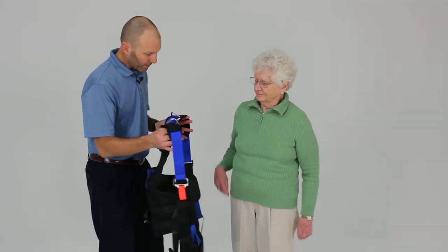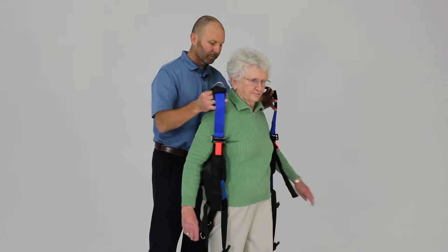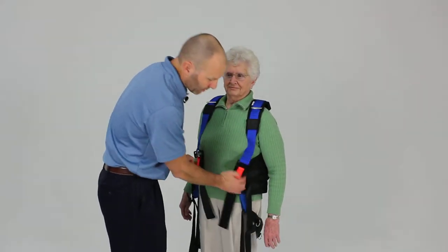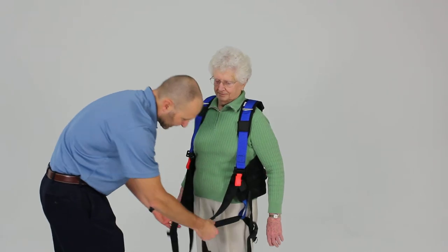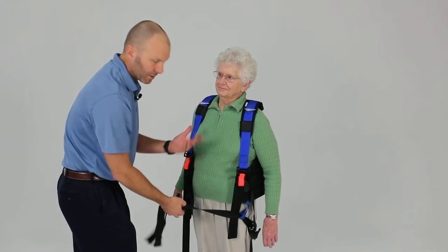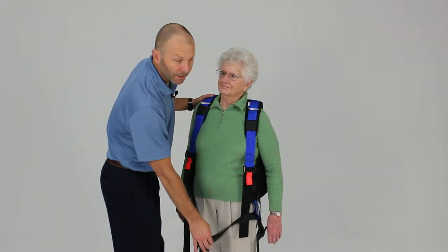In that way we just have to place it on like so, and then we can go ahead and snap our front buckles. Then we have easy access to the pelvic support strap, which is going to be crisscrossed in front of the patient, just as we showed you in the previous portion of the video.